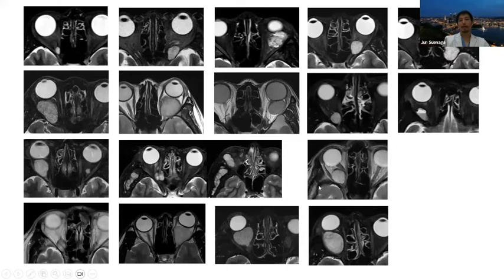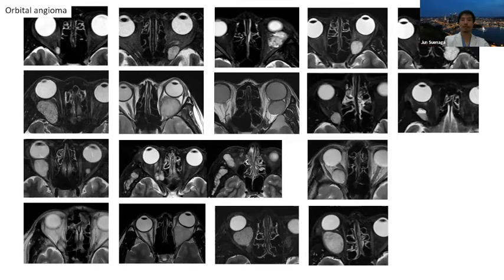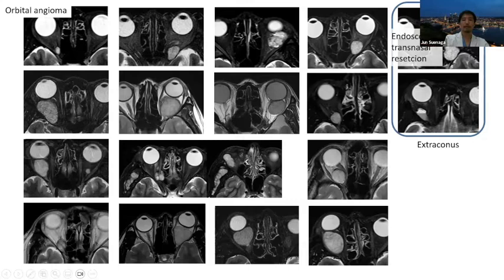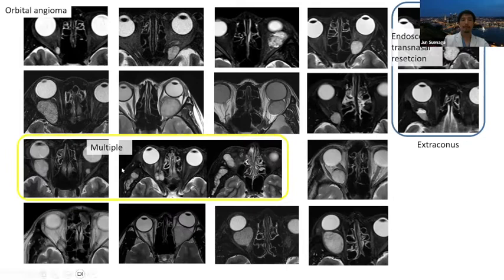First, I'd like to show orbital angioma images. The feature is MRI T2 images showing very high intensity and well-demarcated tumor, with mixed enhancement on contrast images. Some occur in the extra-conal region but mainly in the intraconal region. In this area, endoscopic transnasal resection is suitable, especially for tumors inferior-medial to the optic nerve. Some cases are multiple — involving both sides or multiple areas.